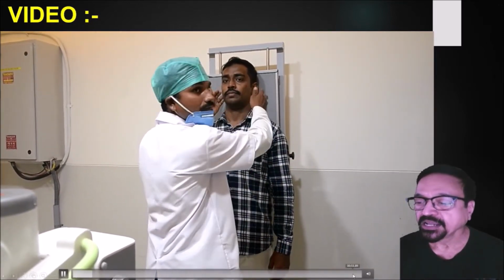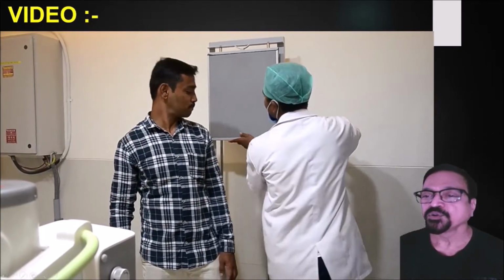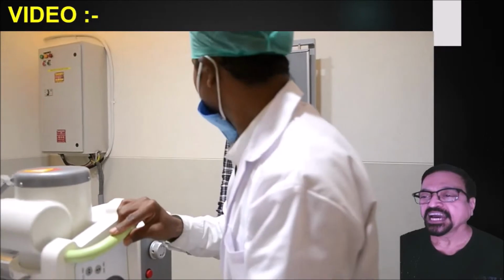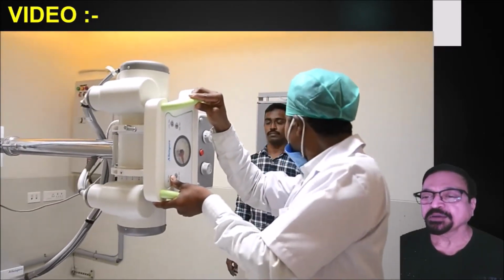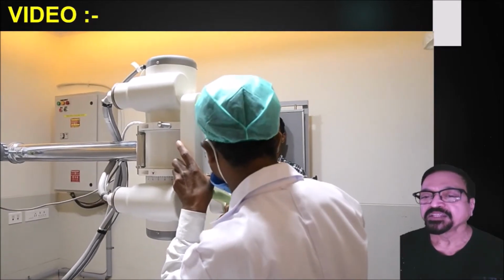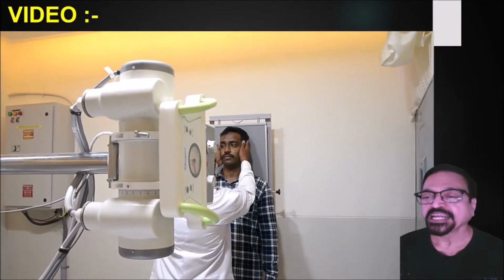Now here it is shown with the standing patient. In our department we prefer it for rapid turnover. And second, in the same position we can project multiple films. Now the cassette we are using here is a CR cassette. We have both CR and DR in our department, but here we are using a CR cassette. Here we are not using any bucky or any grid.